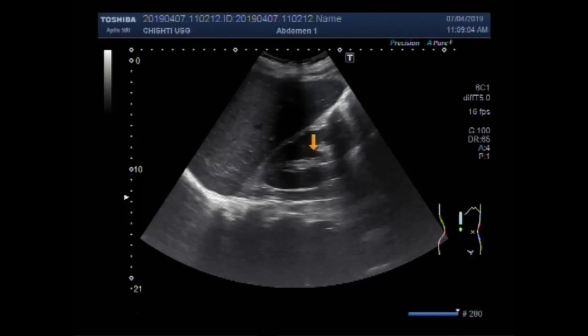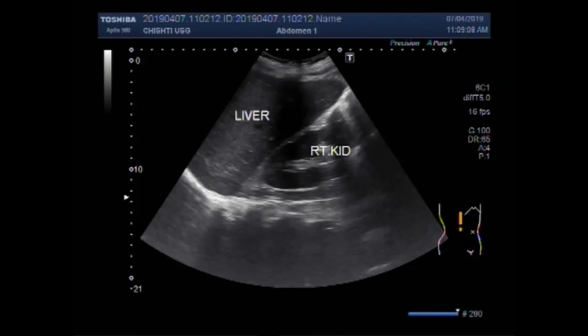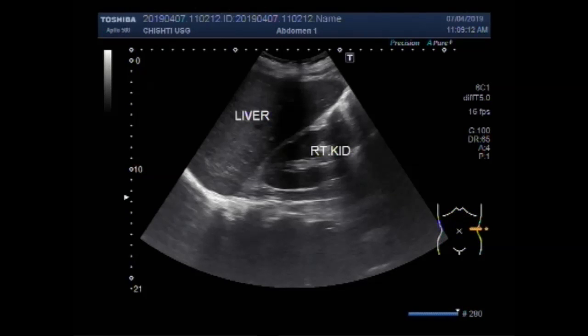Now this is the right kidney and this is the liver. The patient is in the side-down position.